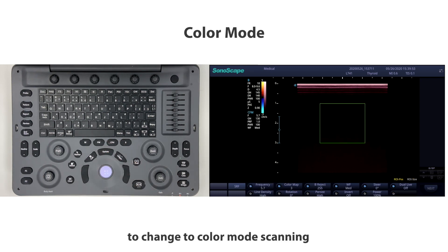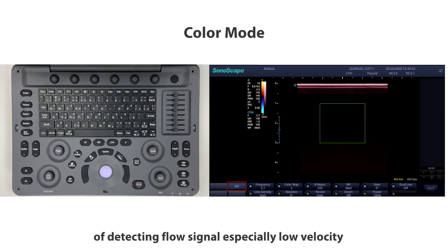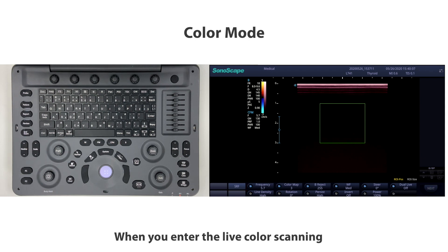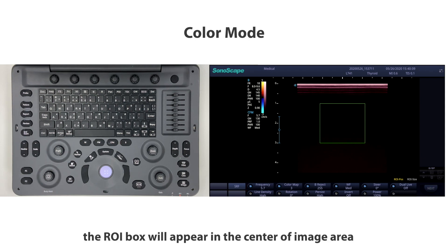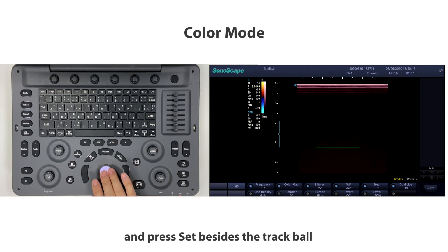After finishing B-mode scanning, press the CFM button above the central control area to switch to color mode scanning. You can also activate SR Flow by key function to improve the capability of detecting flow signals, especially at low velocity. When you enter live color scanning, the ROI box will appear in the center of the image area.